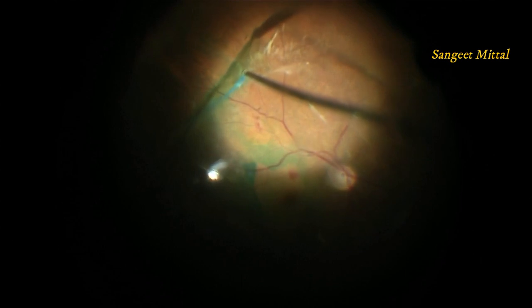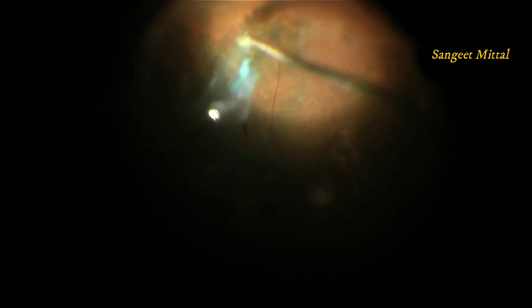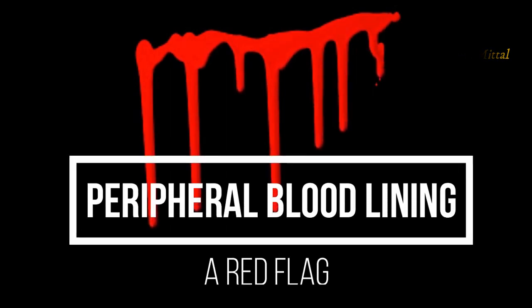In the end, it could be said that the presence of peripheral streak of hemorrhage means incomplete removal of vitreous. This layer of vitreous is tightly adherent to retina and may need the use of triamcinolone or peeling of ILM to separate it. Active suction should be applied in anterior to posterior direction to peel this layer. Peripheral blood lining is not a red herring and cannot be ignored. It may be a sign of vitreoschisis. It is a red flag.